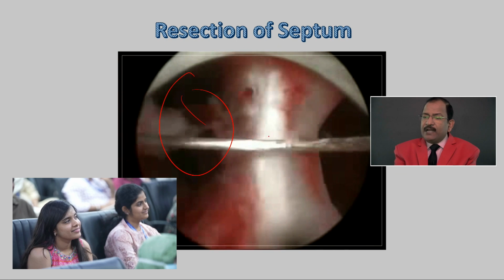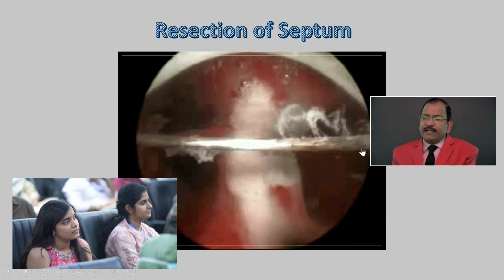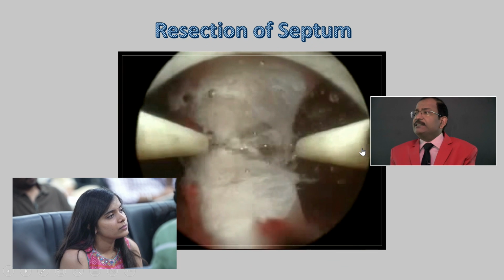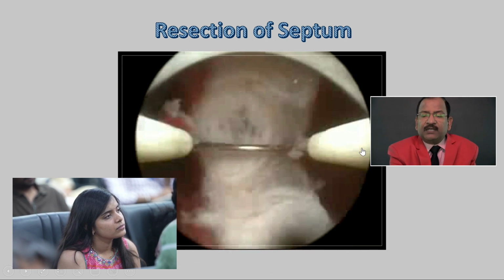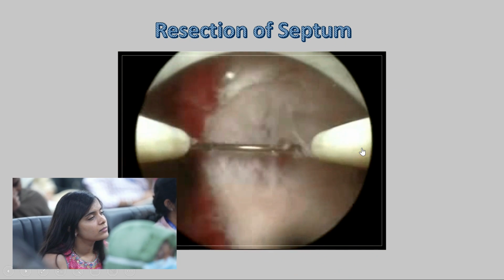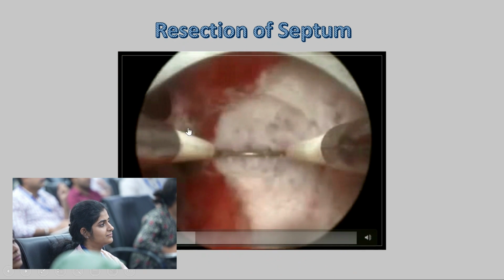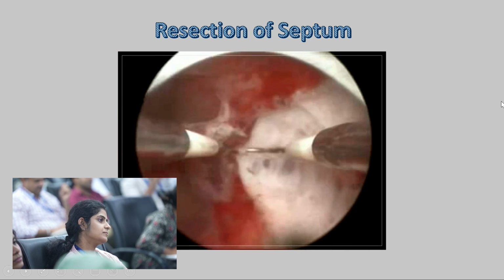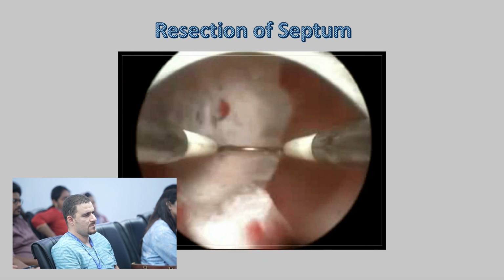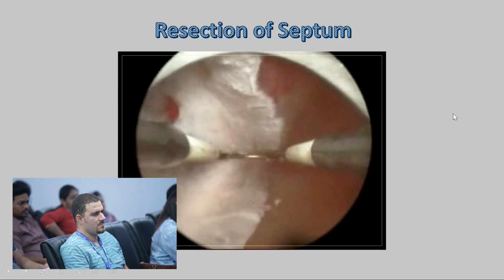Right now it is dark either side, but once you keep on cutting small bites, as soon as you reach the fundus, you will see the texture change. And once the texture becomes bright, you should stop. Brighter is nearer, darker is deeper. Now see, the texture is coming nearer, and that means it's time, the left side is almost over. Because if you are too enthusiastic, from a small cavity you will enter into a large cavity.